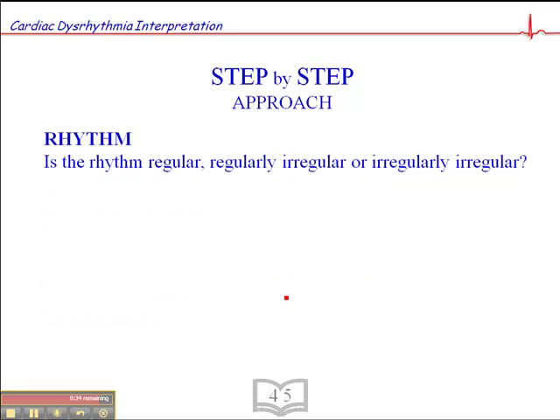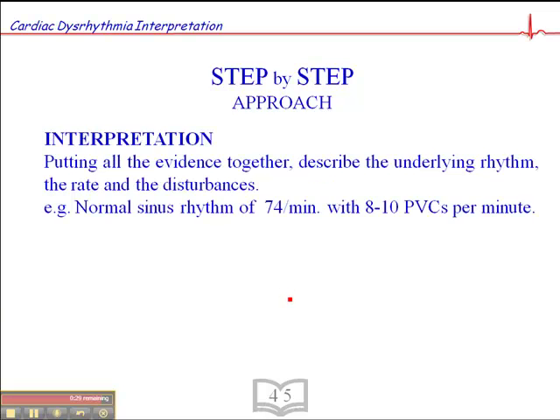Finally, we look at rhythm: is it regular, regularly irregular, or irregularly irregular? When we take all that information, it helps us formulate an interpretation. When we describe rhythms, we always start with the underlying rhythm first, then the heart rate, then the unusual beats. For example: 'This is a normal sinus rhythm with a heart rate of 74, with 8 to 10 PVCs per minute.' We do that consistently with all rhythm interpretation.